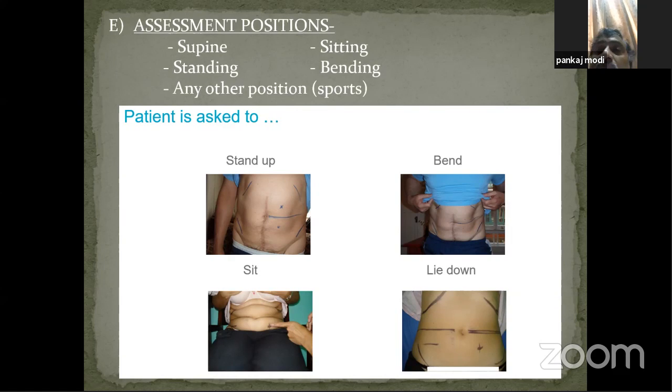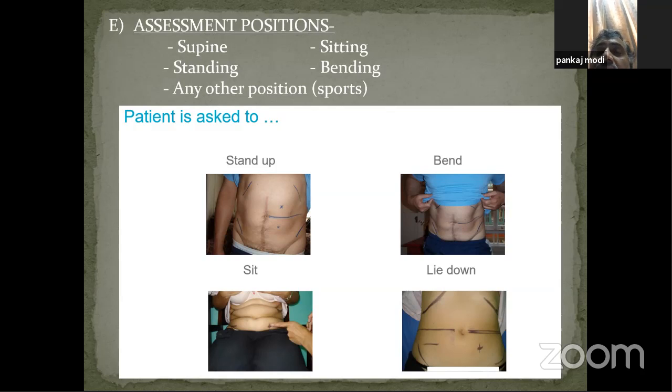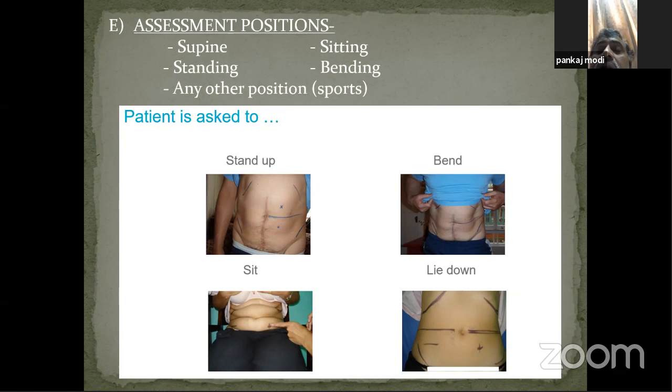We are talking of a temporary loop stoma. Yes, sir. In that case, will you get time for all this? Sir, this is the ideal way, but... No, nothing like ideal way. How many times in your 2 years of practice in emergency have you done this? Not a single one, sir. So what is ideal? This is meant for a permanent stoma, not for an emergency or temporary stoma. Don't give the wrong message. How can you do it for an emergency stoma?